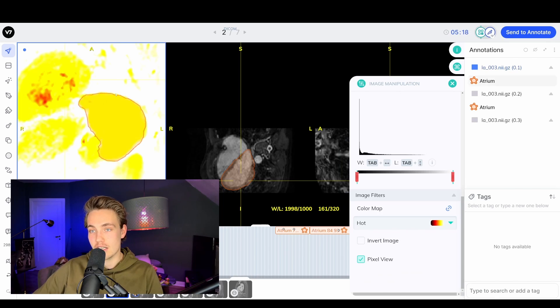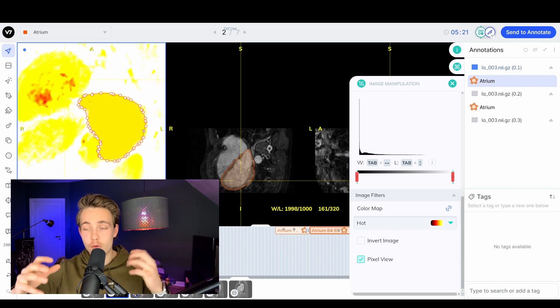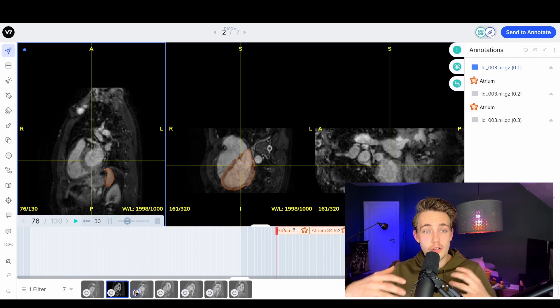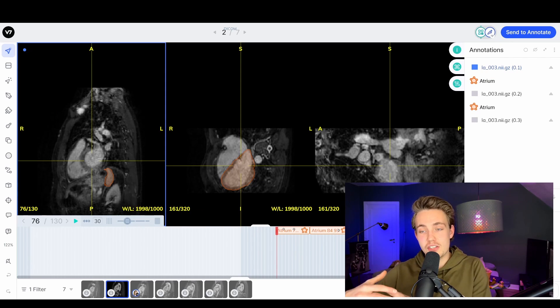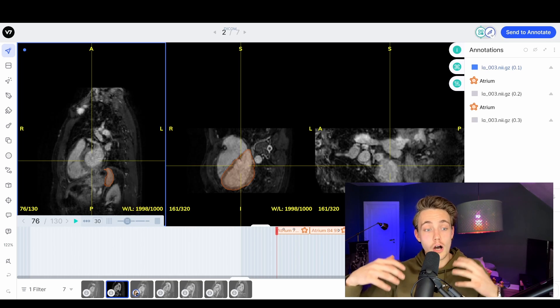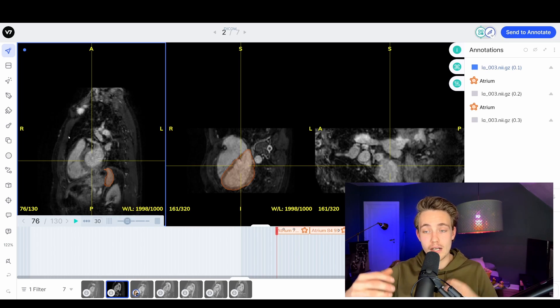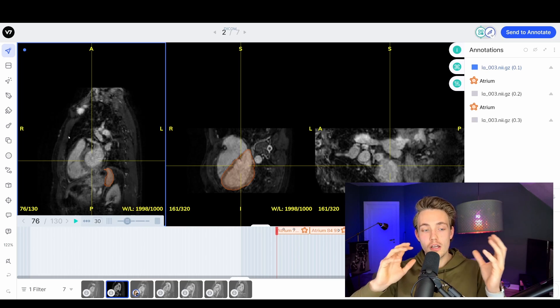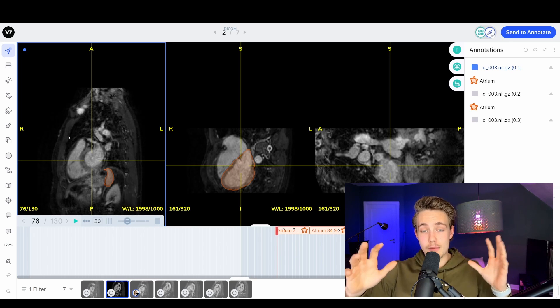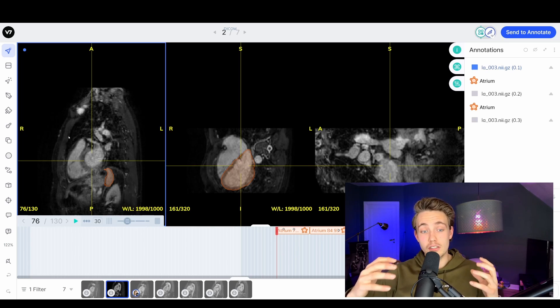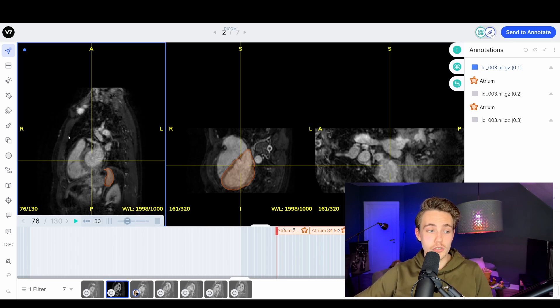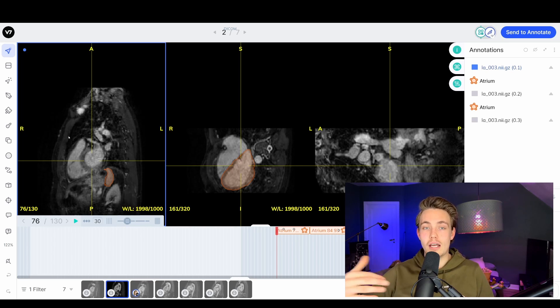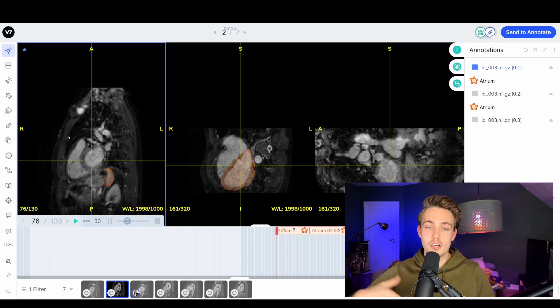Here we have a really nice yellow border around our structure. That can improve our annotations and when we improve annotations we will also improve our models. One of the other cool things with V7 when doing annotations on DICOM medical images - for example on volumetric data like the heart or brain - is that these annotations are in millimeters and not in pixels, so we don't have to do the conversion ourselves. This is a game changer because it's important and really easy to understand the size of tumors. It is just easier when doing annotations in millimeters and also when training our models compared to pixels.